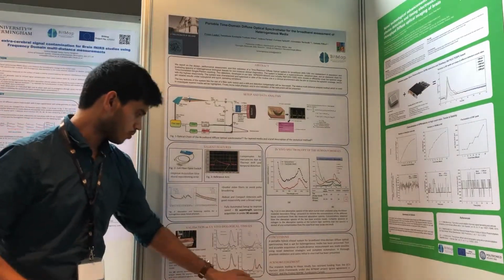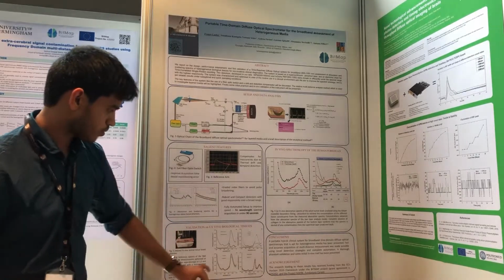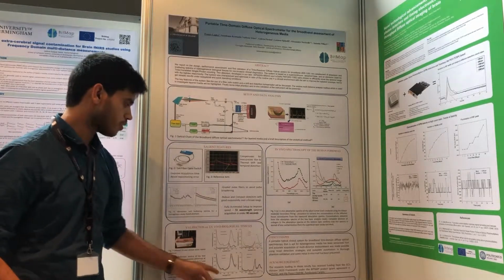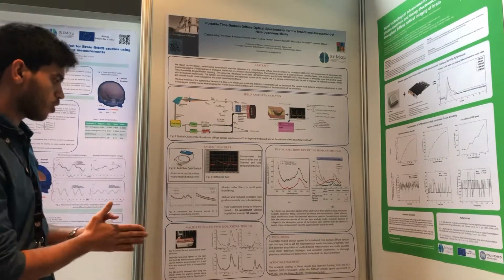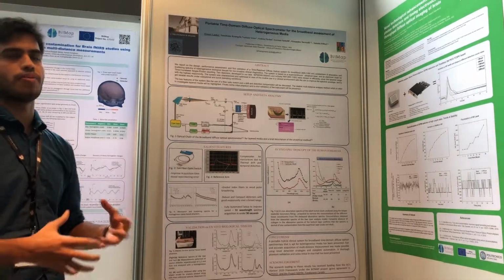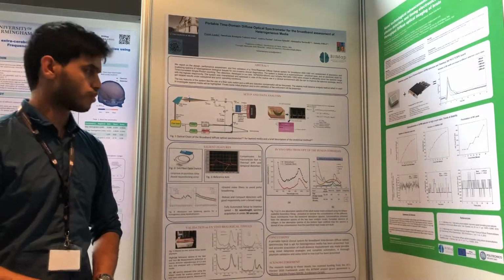And on the bottom you see the comparison with these reference values and the retrieved optical absorption properties of the top and the bottom layer. Here you see there is a very good agreement in both the bottom and the top layer, very well retrieved. Typically the coefficient of variation is under 10% throughout the spectral region.